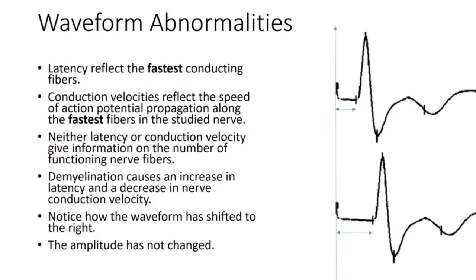Now, when we were looking at the waveforms, there were a couple of things I wanted to point out. One was to look at the latency, which is the time it takes for the action potential to travel from the stimulation site to the recording site. In this picture on the right-hand side, we have two waveforms. The amplitudes are the same, but the latency, or the time that it takes for that impulse to reach the recording site, is longer. This horizontal arrow is longer on the bottom than it is on the top. If you put these two right on top of each other, you would just see that one has shifted over to the right.